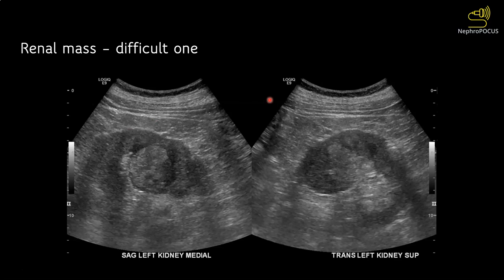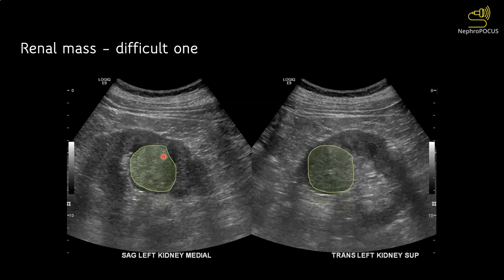Here is another example where the mass is not growing outwards but is within the kidney. If you closely observe, you see a discontinuity in the renal parenchyma — here is one medullary pyramid, here is another pyramid, but in between there is something. This renal mass was also found on further investigation to be renal cell carcinoma.